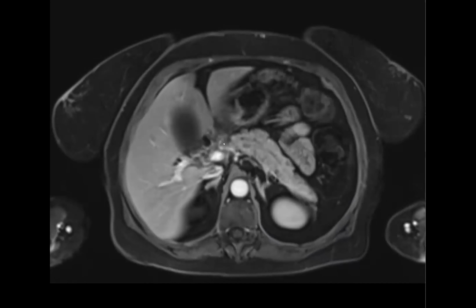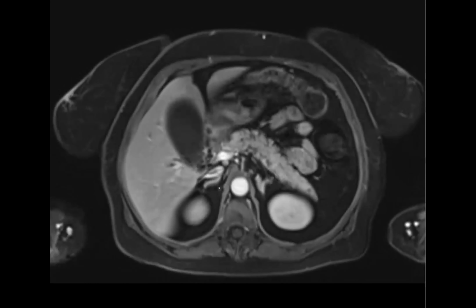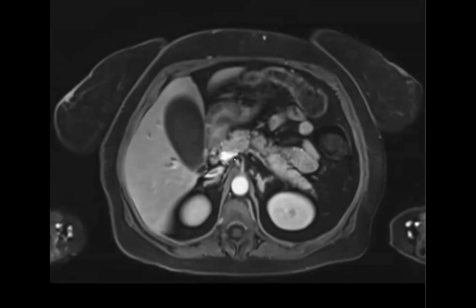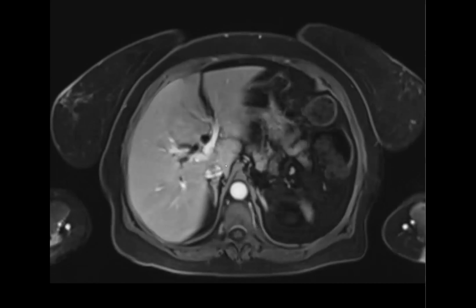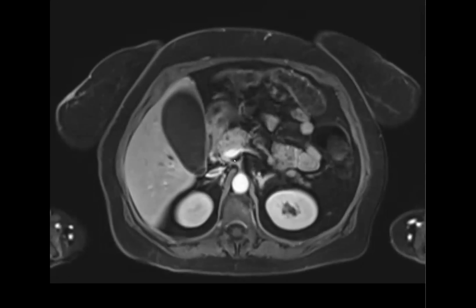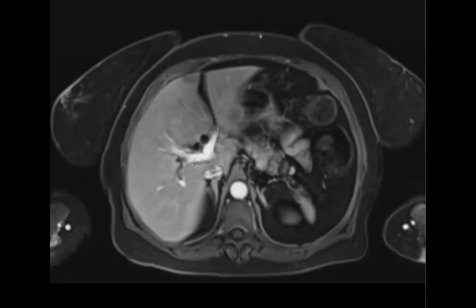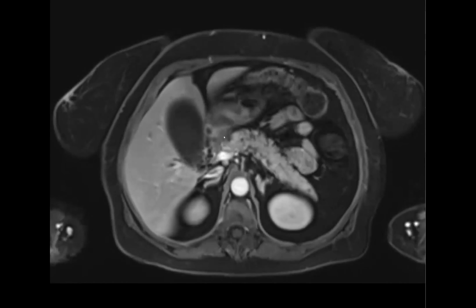The main issue here is going to be the hepatic artery, because you can see that this hepatic artery becomes encased by part of the tumor here. The cool thing in this patient is that the proper hepatic artery and the left hepatic artery get encased by the tumor, but their right hepatic artery is actually aberrant, arising from the SMA. It goes posteriorly here and feeds the right side of the liver. And you can see that this portal vein is actually protecting this right hepatic artery from the mass.